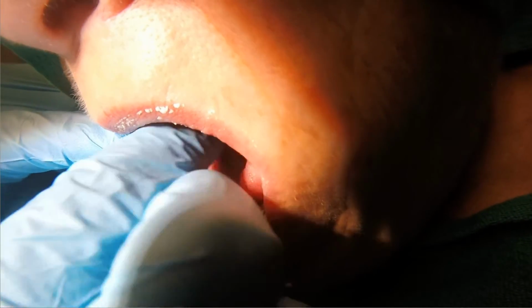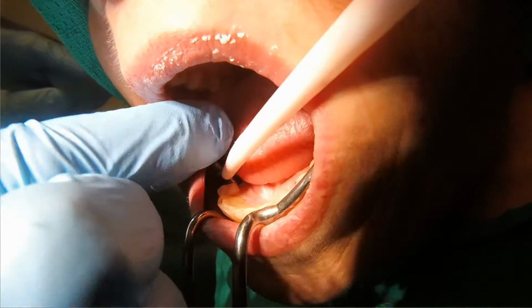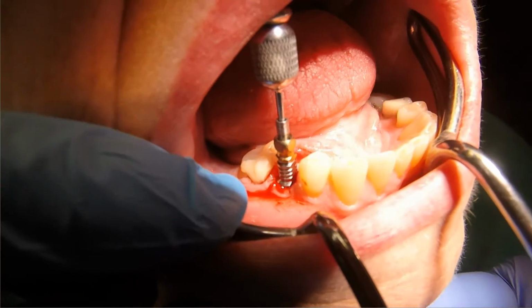you can also assess the lateral stability of the implant at this point. Once the impression coping is in place, just by bouncing it between the two fingers, it should be harder than the Rock of Gibraltar.